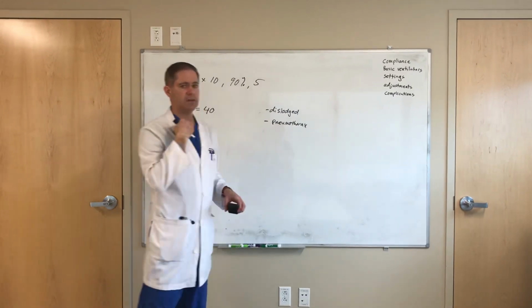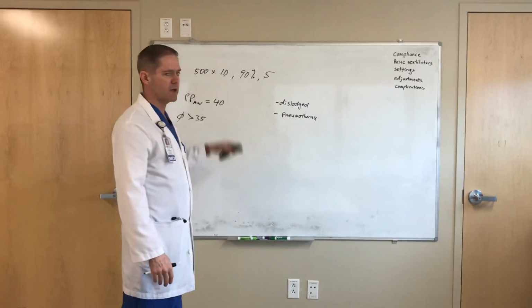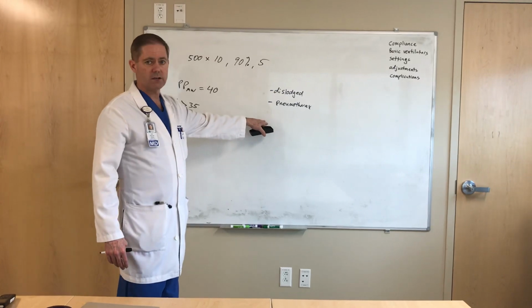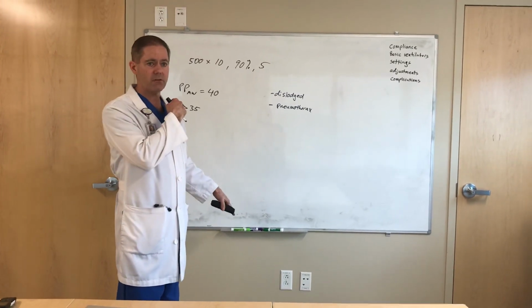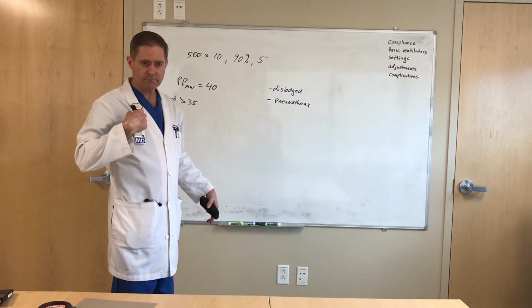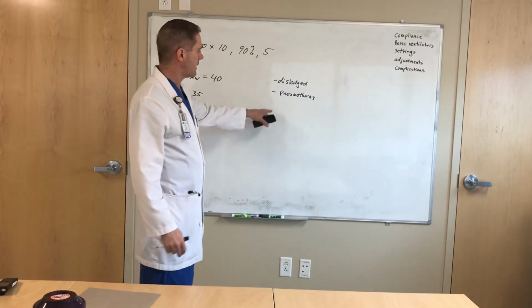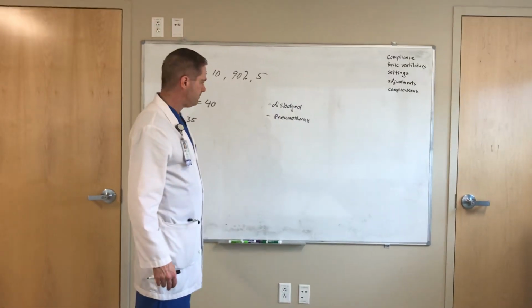If you've got tracheal deviation, you have a patient who's hypotensive, you have high airway pressures and low volumes, you're not able to get the volumes in, you probably got a tension pneumothorax. Don't wait for a chest x-ray to get a needle decompression on whatever side. So if my trachea is deviated to the right, put a needle mid-clavicular line, second intercostal space. Find the angle of Louis, come over to the mid-clavicle, go down, hit the rib, go right above it. Okay, and then you have to proceed with a chest tube.